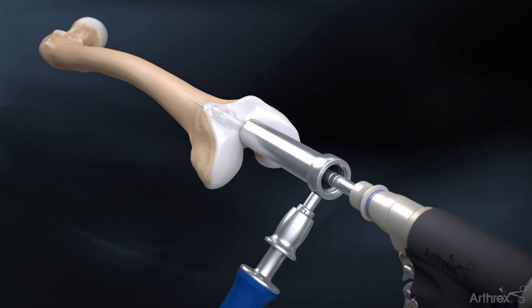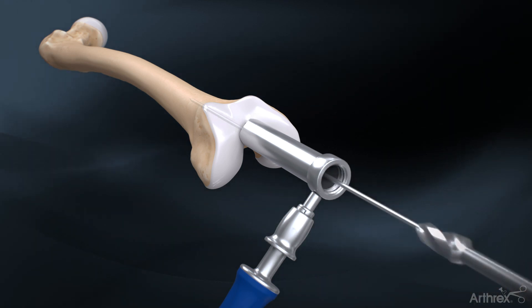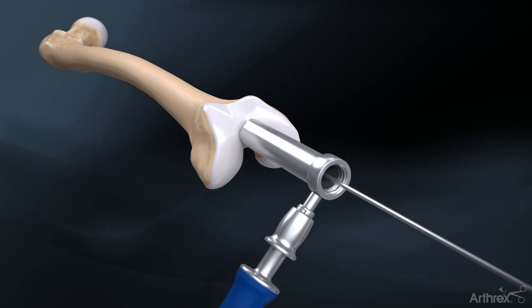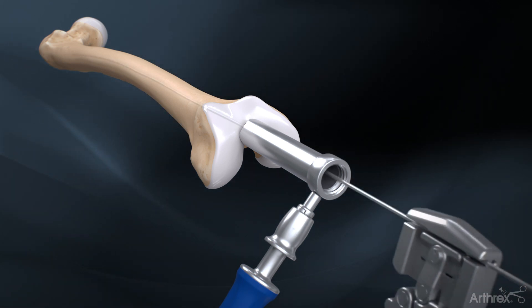The grooves represent how many millimeters the nail will be countersunk. The first line represents 5 mm. The 3.2 mm guide pin is then removed and the 3.0 mm ball nose guide wire is introduced down the shaft of the femur using the guide wire gripper.